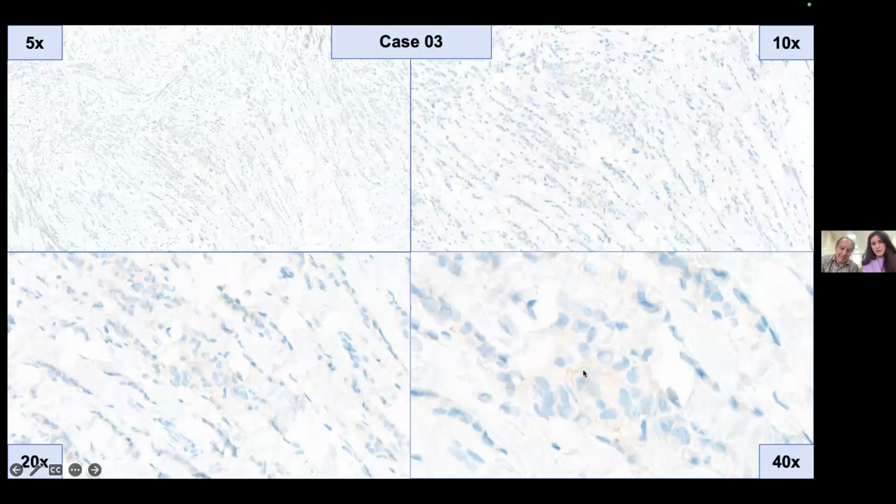But actually, especially in a case like this, there is a tiny little bit of membrane staining. Obviously, nothing here, nothing at most of it. It looks more cytoplasmic at low power. But can you see at times 20 here, there is the occasional line. I'm not so sure. Let's put times 40, and you may or may not be convinced that this is membrane staining. If you are convinced this is membrane staining, this would probably be ultra low.